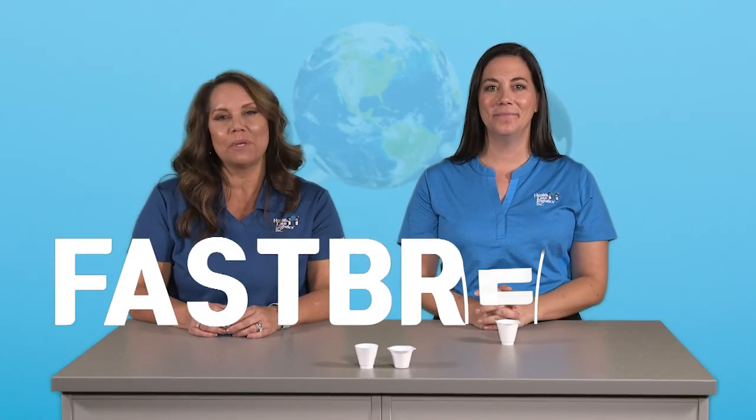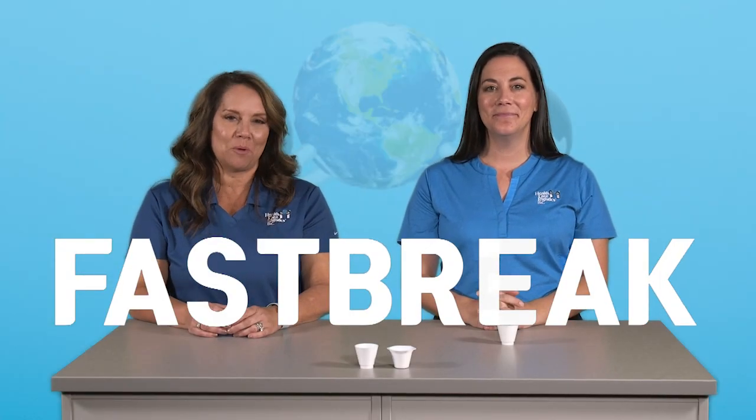Welcome to HCL's Fast Break, where we take a quick moment to showcase an HCL product or service. Our featured solution is the medication crushing cup cutter set, which can withstand heavier pressure than ordinary med cups. This set is handy because it combines the task of cutting and crushing, and it's easy to use, especially at a patient's bedside.